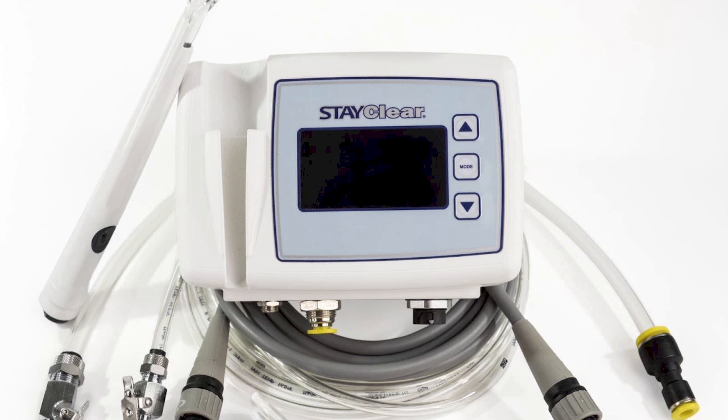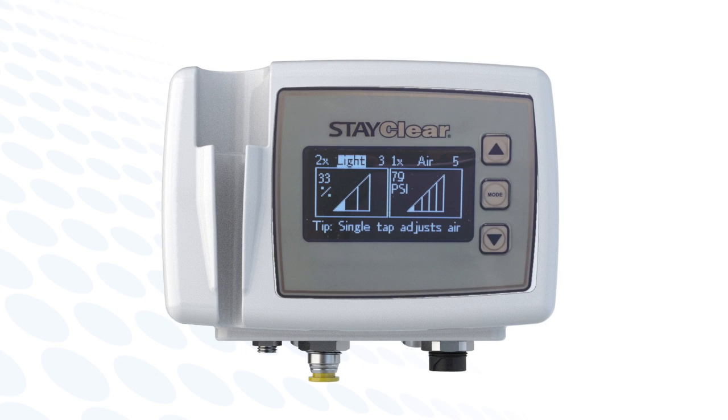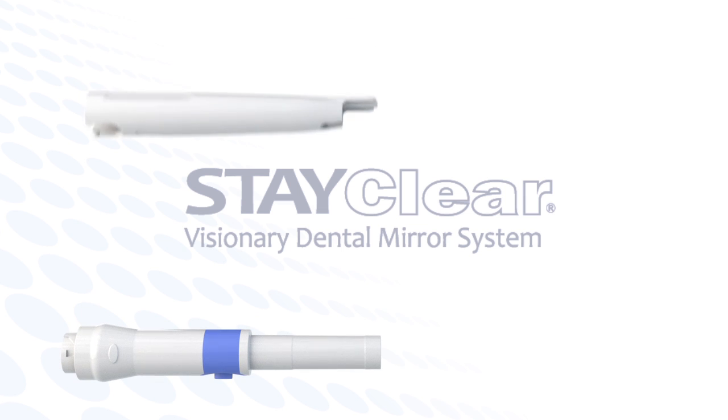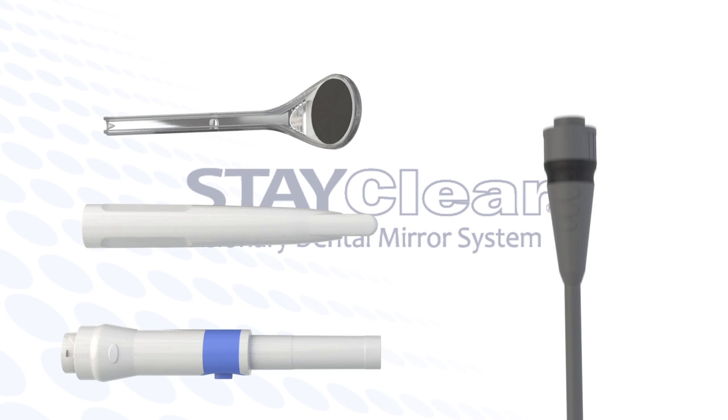The StayClear system is made up of the following components: the patented StayClear display and cradle, which offers the user set-able modes for light and air; the handpiece body that delivers both light and air; the autoclavable sheath; the single-use StayClear mirror; and the umbilical.